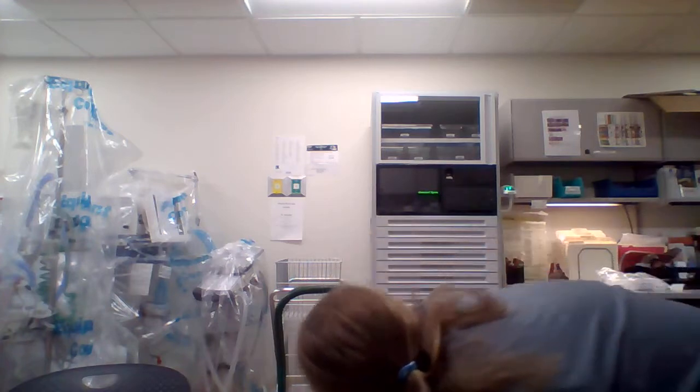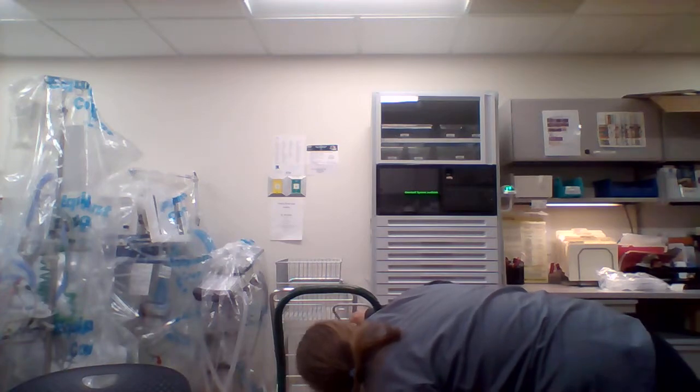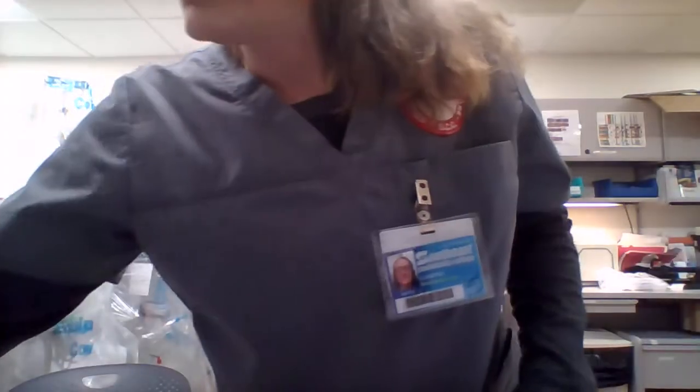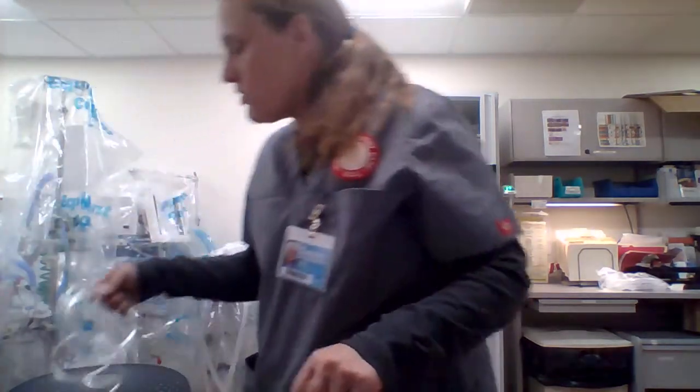To know how long this would last me, I would look at it, and it's on green. It's showing right at 2,000. So it's an E-cylinder, so we would take the tank factor, which is 0.28, times 2,000. Well, I would subtract 500 for the safety. You don't want to get that last 500 out. There can be dirt and debris in it. And let's say I was going to use a nasal cannula at 4 liters a minute. That would give me not quite 2 hours, like 1 hour and 45 minutes, 1.75 hours of time.